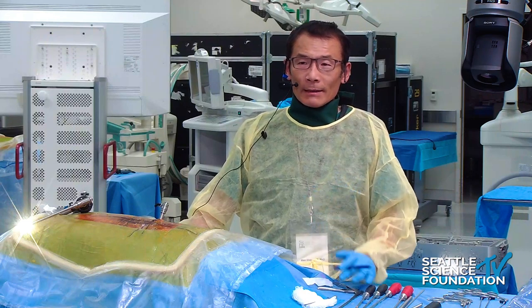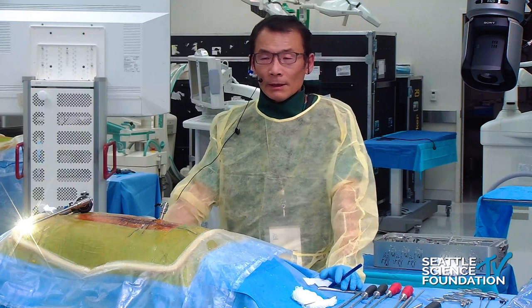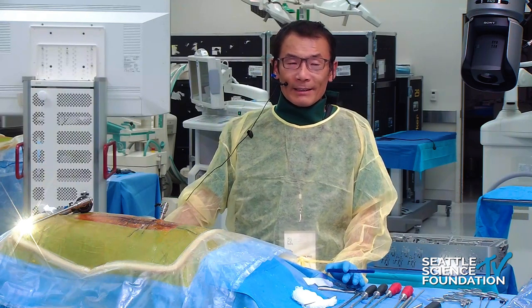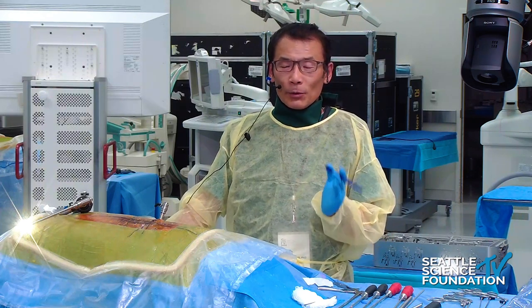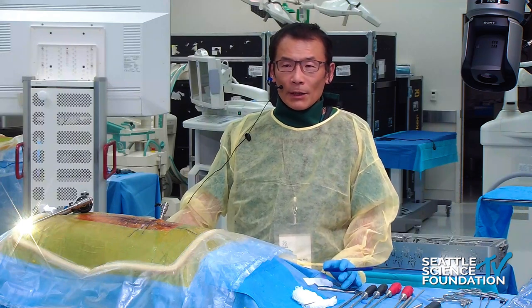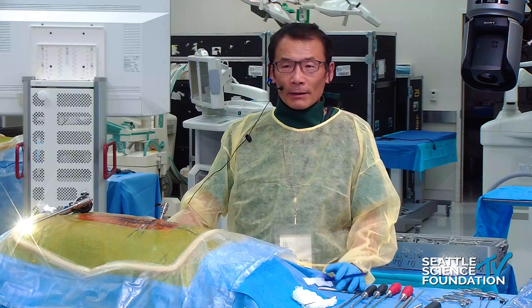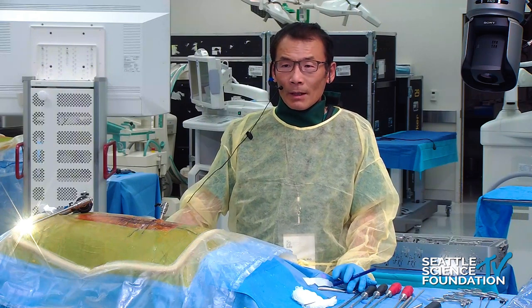It's usually just outside, on the AP view, lateral to the pedicle. And then on the lateral, it's right in line with the disc space. Because when you do fusion, you really want a straight shot to the disc space. You do not want the angle cranial or caudal, because you can damage the end plate. So that's my workflow.